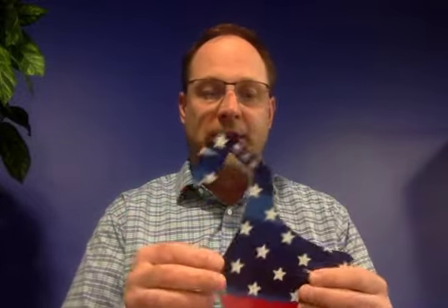Hello, I'm Tom Scripps here with the Superior Defense Mask, and I'm going to show you how to use the mask and make adjustments. Now, starting off, before you touch this mask and any mask, you would want to wash your hands either with soap and water or a hand sanitizer, because you don't want to be contaminating the mask or your face with whatever's on your hands.